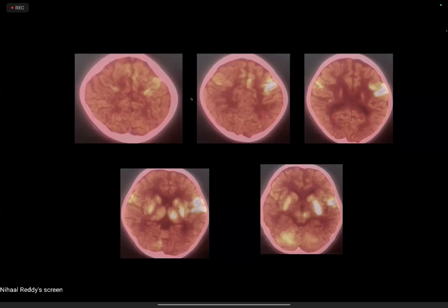Question of spectroscopy, we did not suspect mitochondrial on the initial scan. The PET CT was done after the MRI, so I think MR spectroscopy wasn't done. I'll open the case if anyone wants to add comments. I think Sridhar has mentioned possibility of mitochondrial pathology and Rasmussen encephalitis.